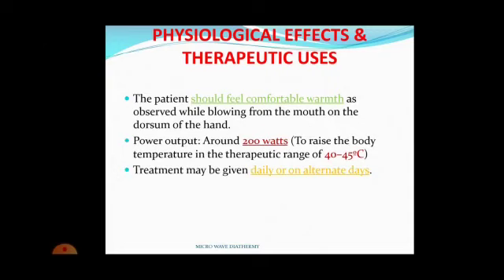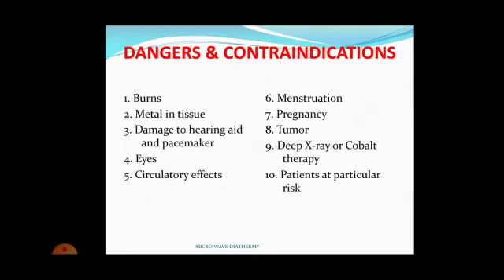Now, treatment may be given daily, or on alternate days also. It depends on the severity of the patient's condition. Now there are a few dangers and contraindications we are covering under a single title. First of all, we need to take care of burns.